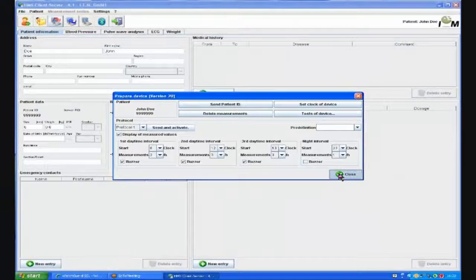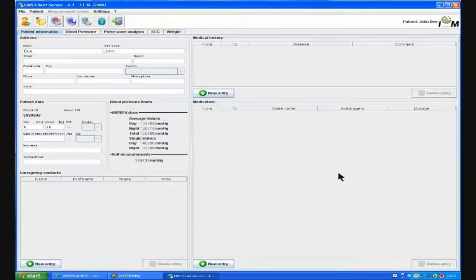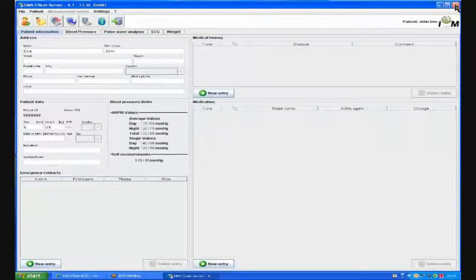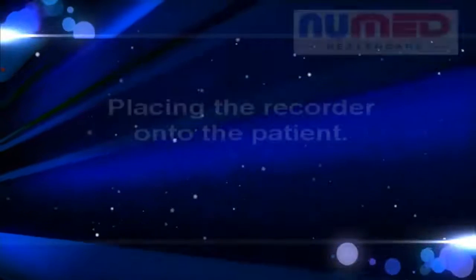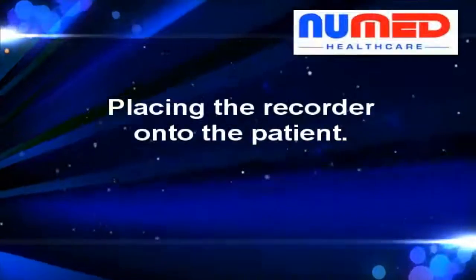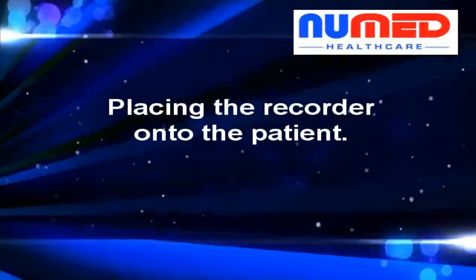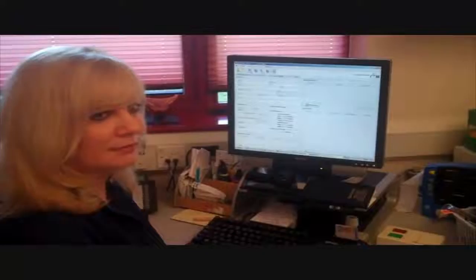We can then send the patient ID to the recorder by pressing the red send patient ID button. Once the patient ID has been stored, the program can now be closed. We are now ready to place the recorder onto the patient.